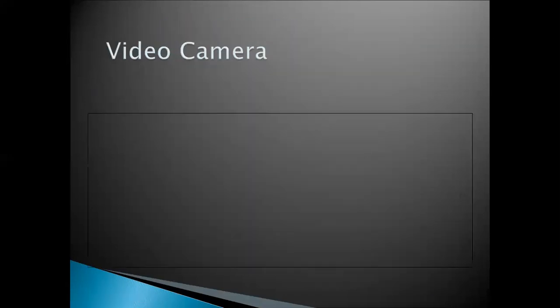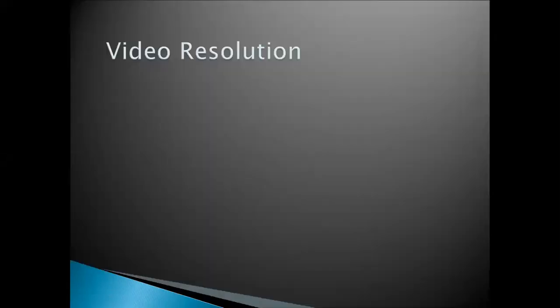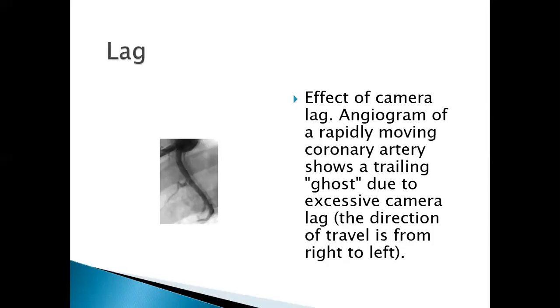I saw this last time with the video camera: the lag, which is a problem with some image intensifiers. That is, a residual image disturbs a particular image that we are viewing.